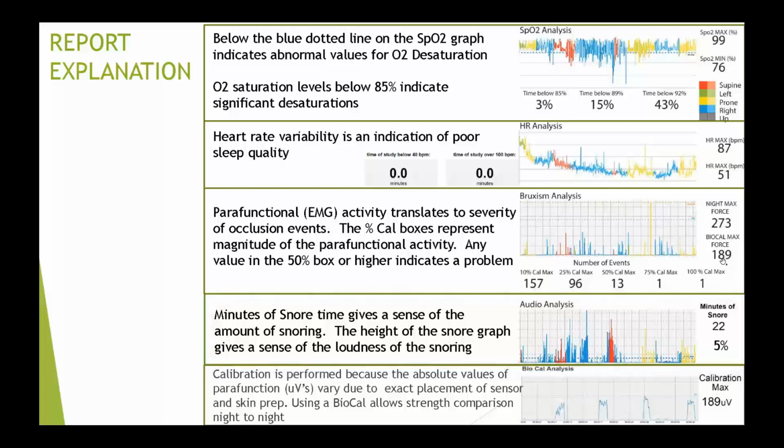Okay. And then finally, the calibration. This is just a graph of the waking cal test. So we said bite down as hard as you can, and you can see these graphs here are what we're talking about.